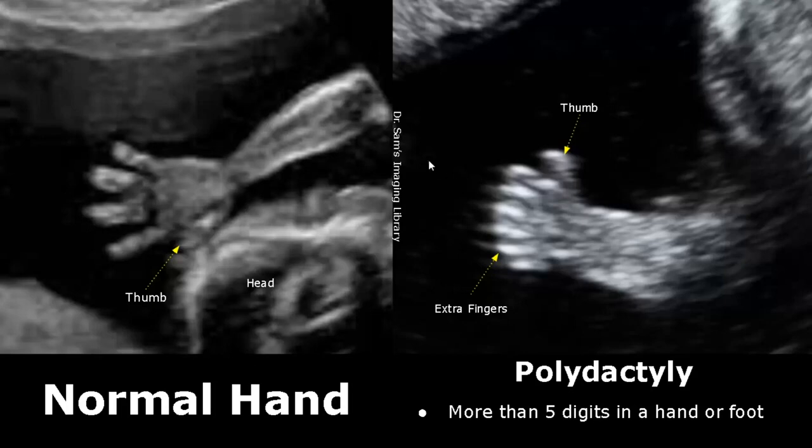Most musculoskeletal abnormalities are seen in the late second trimester and the third trimester. We will start by looking at fetal hand anomalies. On the left side, we can see a normal hand. The thumb and forefingers can be seen normally.